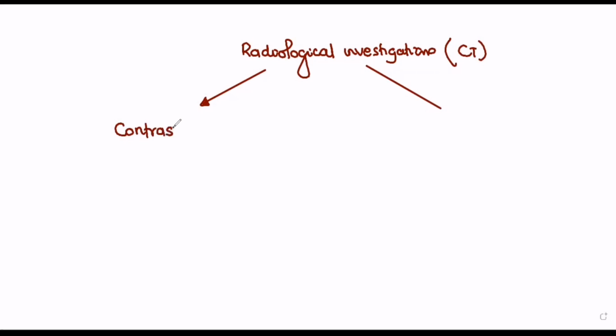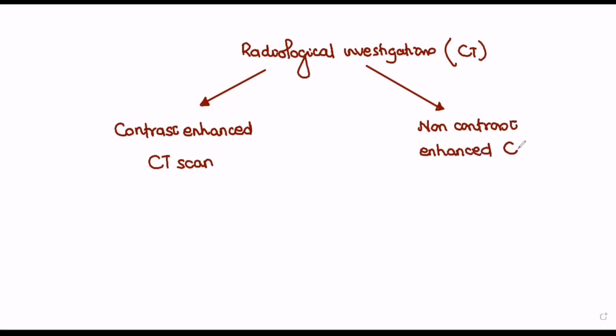Is that okay? A contrast-enhanced CT scan, maybe the lesion you are looking for in the brain. If you don't add contrast, you will not see it. Then the opposite is a non-contrast enhanced CT scan, one we took without giving a contrast. Another name is a plain CT scan. It means that you didn't add anything. No contrast. Are you good? Yes, sir. So a contrast enhanced CT scan, a non-contrast enhanced CT scan, or a plain head CT scan, okay?